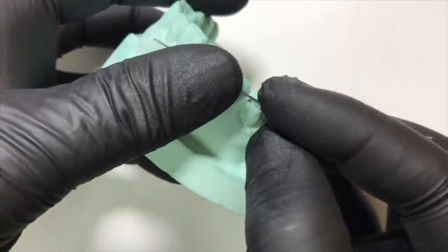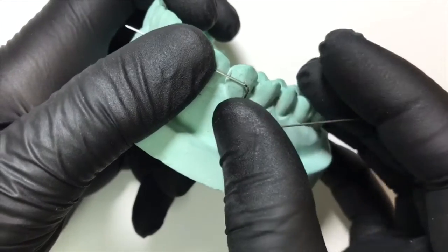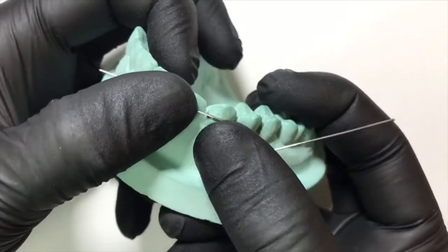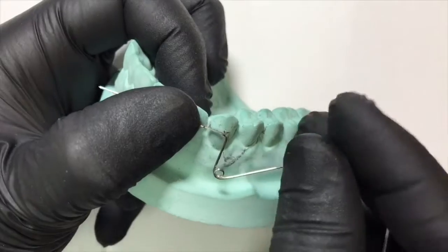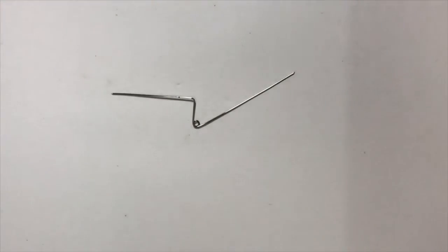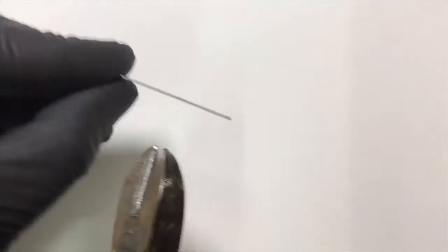We check the adaptation on the canine — the one end of the active arm should rest in the embrasure mesial to the canine. We give another marking where the active arm would end, then cut off the extra amount of wire.